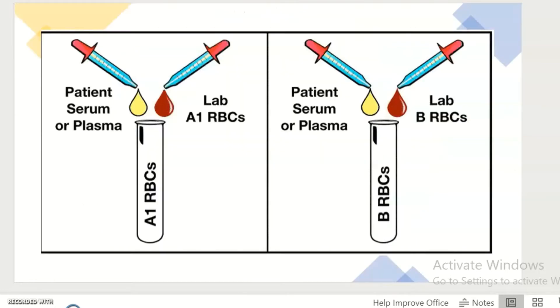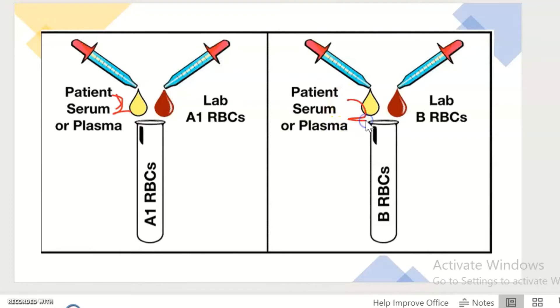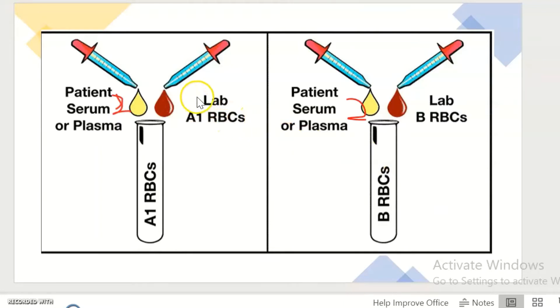Firstly, let's see the procedure of reverse grouping. Label two clean tubes: A1 RBCs and B RBCs. Add two drops of patient serum or plasma in both the tubes labeled A1 RBCs and B RBCs. And add one drop of A reagent RBCs to the tube labeled A.